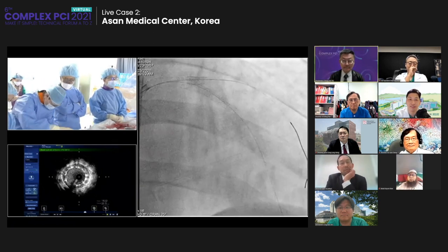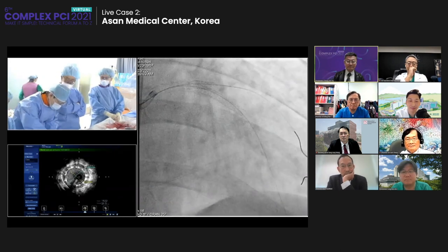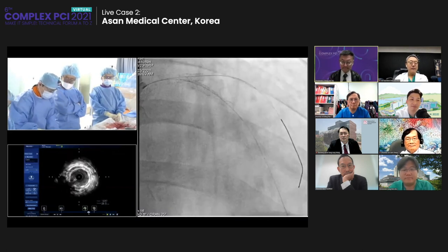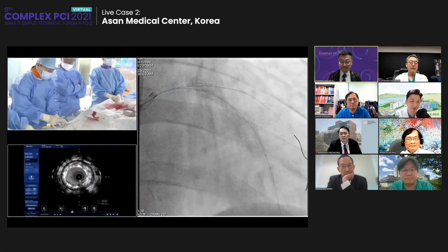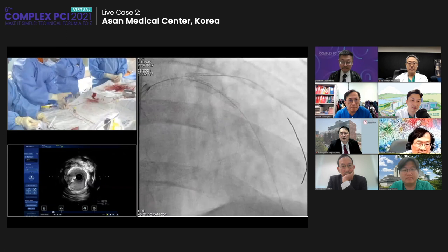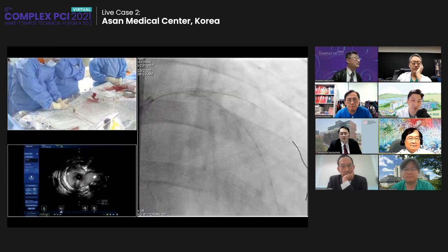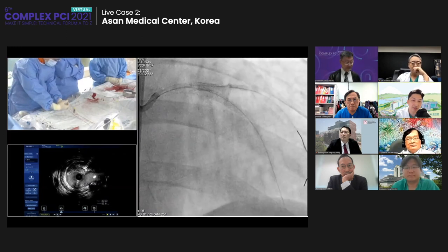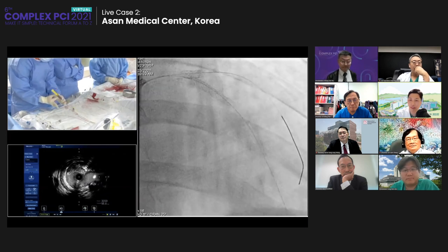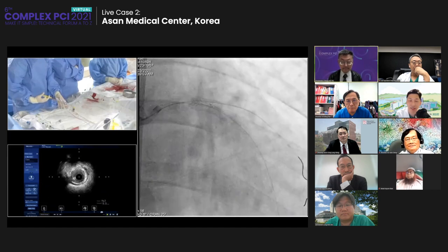Nitroglycerin infusion after opening the occluded artery. We have to see what's happening in the distal part of chronically adapted vessels. We do the RCA angiogram to see whether there is collateral to the distal LAD or not. Yeah, that would be a good idea also. Infusion. Oh, we could see the distal. Adenosine, verapamil, and nitroglycerin.